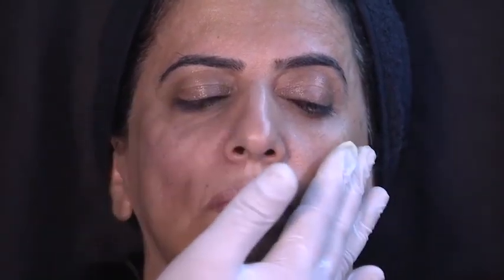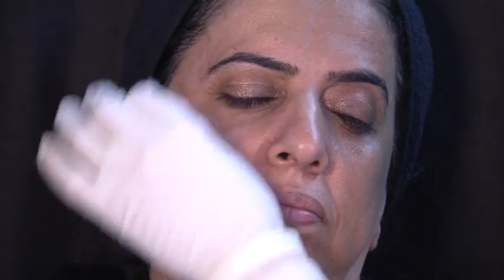Okay? So finally, I want to finalize again with the tear trough because I know it's an area that you really are interested in, and I'm still going to use the same product that I used here. So I'm going to use Vital Light, sorry. You can use Refine or Finesse also. I'm just so used to Vital Light with excellent results, especially with these dark circles, that I want to show you what I do in my clinic.